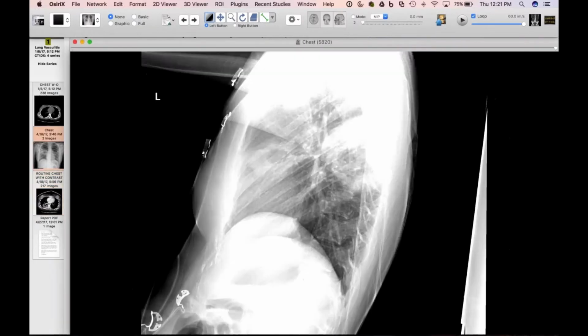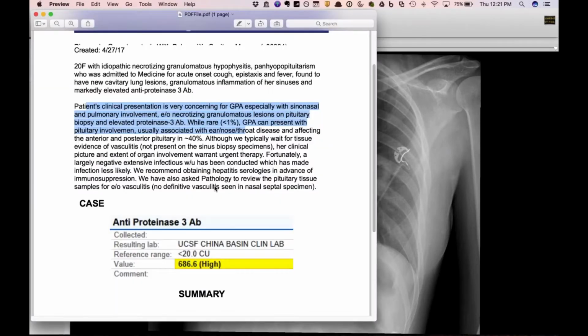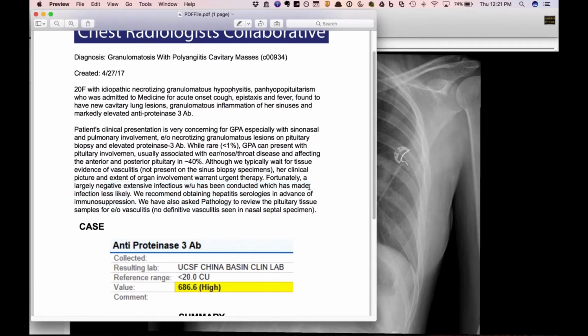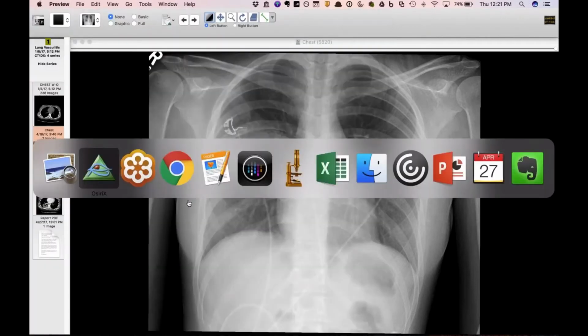So, wow, just yeah, very much. Yeah, it looks like two eyes looking at you. So what if you had sinus disease too? Yeah, I just loaded this one. She had sinus involvement too. So yeah, I think they haven't checked her kidneys yet. I don't know. I just put this together this morning because I just heard from the pulmonary team, but I just thought it was a pretty impressive case.